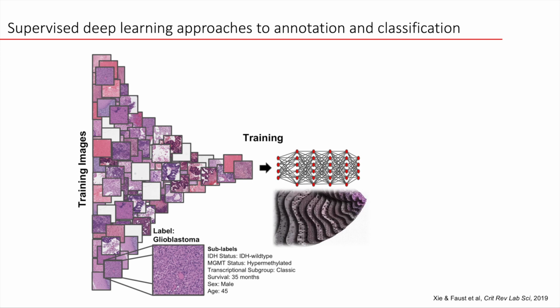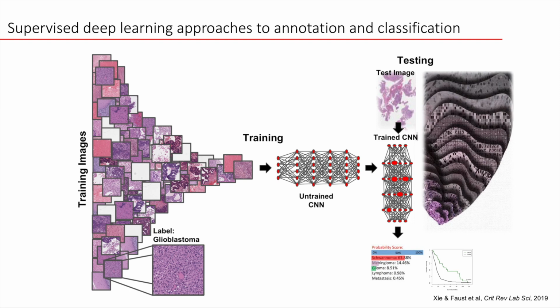At the end, it will try to assess if certain patterns that it generated have any diagnostic value to separate that specific class from other ones in the training set. And doing this iteratively for each and every image, it will generate an optimized neural network where the specific connections have been weighted and optimized to allow making these classifications in future images.